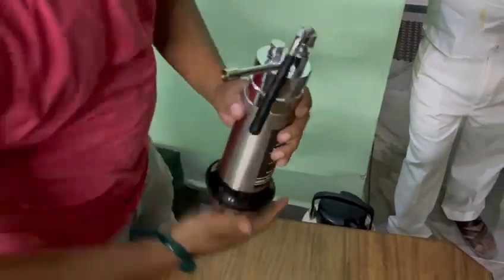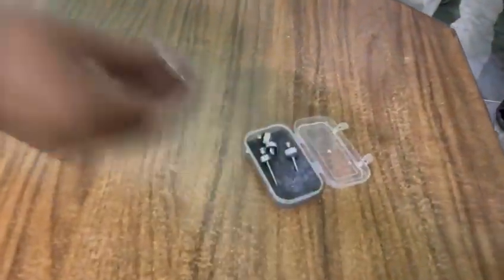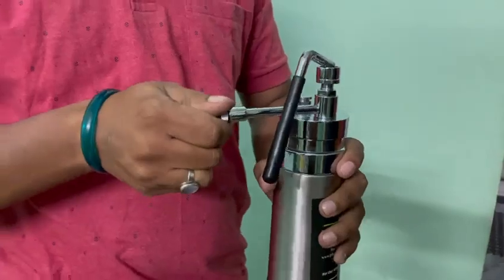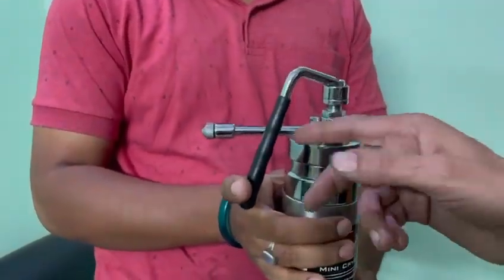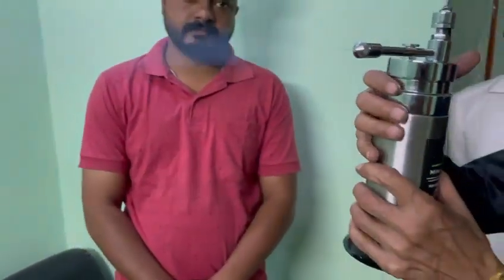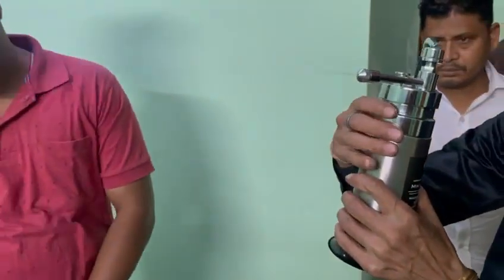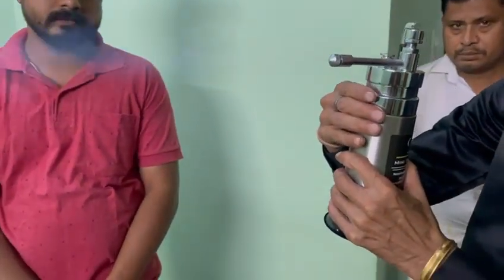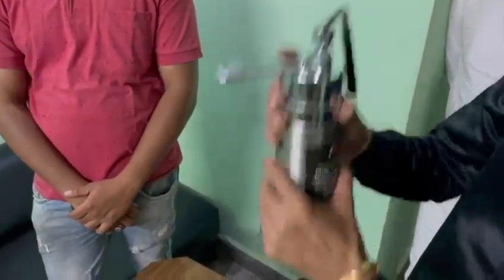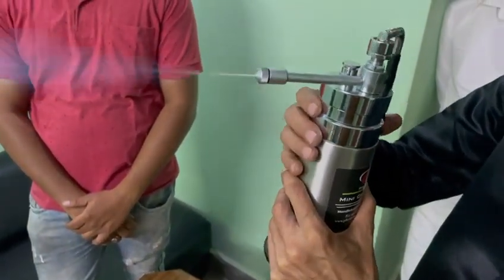Fix any needle — we supply 5 needles along with the cryogen. Simply press the trigger button like this; you can see it is working. If you want to change the pressure, you can adjust it like this.